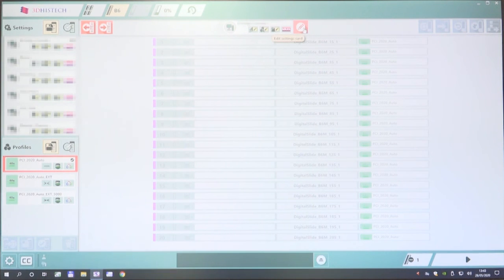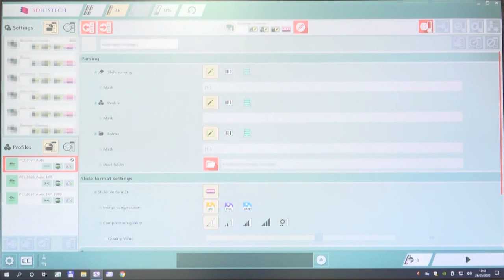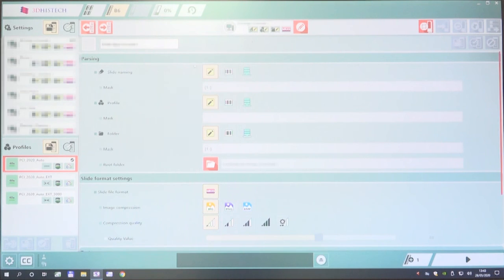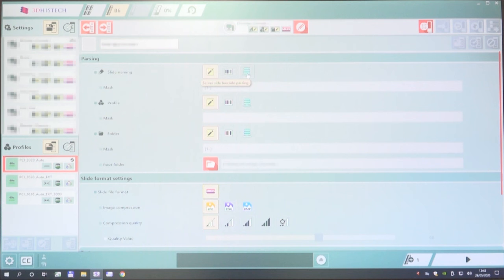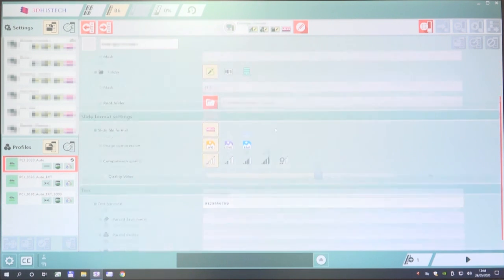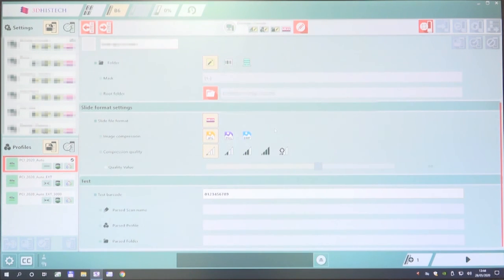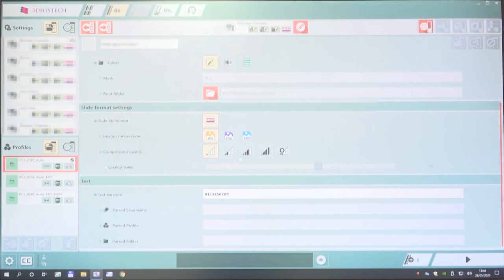We also have settings cards, which show how we translate or input slide name, profile and folder information. This can all be done manually, or with barcodes, or with server-side barcode parsing. You can also select where the slides go as outputs for these settings cards, and you can alter the different resolutions for these outputs.